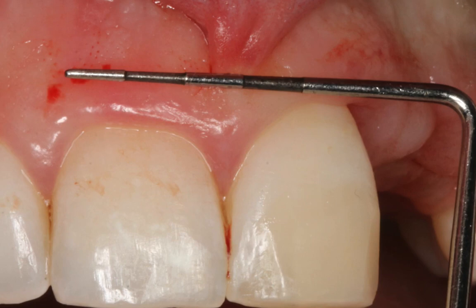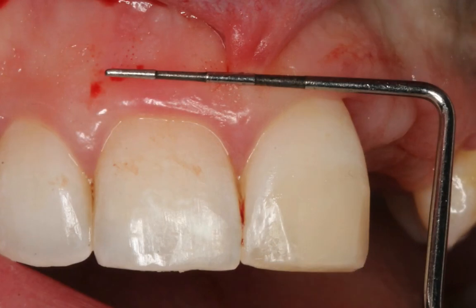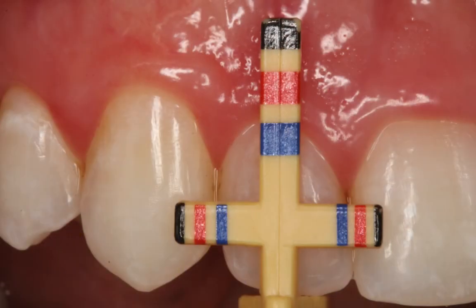And very often I recommend a surgical guide for full arch cases, but in this case we're trying to match first of all the 2 central incisors, and we're trying to create some balance with the lateral incisor, so we don't really need a surgical guide. The other thing that I mentioned in the previous video was that once we lengthen the lateral incisor, we are likely to expose cementum, dentin, basically root structure, because from what I saw using the proportion gauge, the proportions were perfect on the lateral incisor, and therefore I expected to have some root exposed. So let's see how this happens.